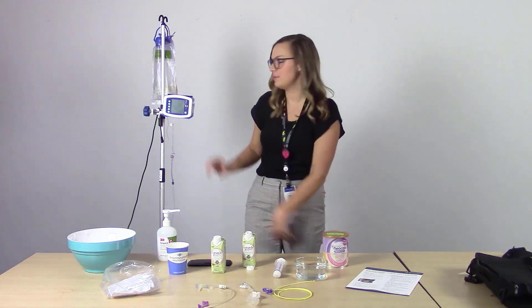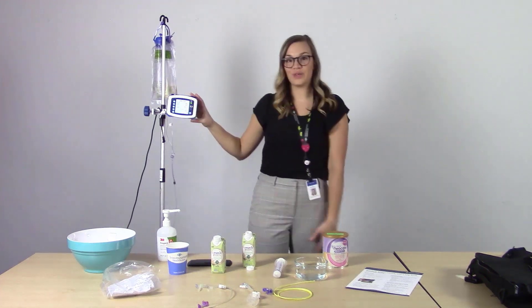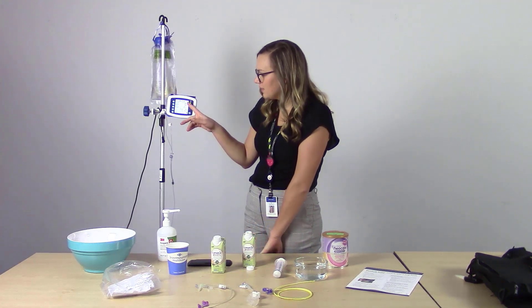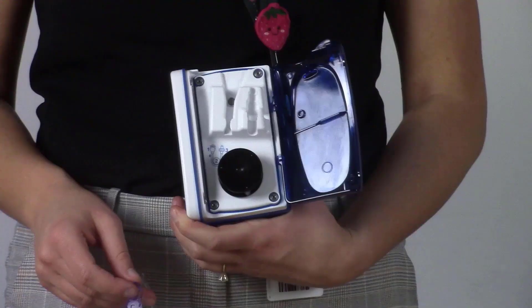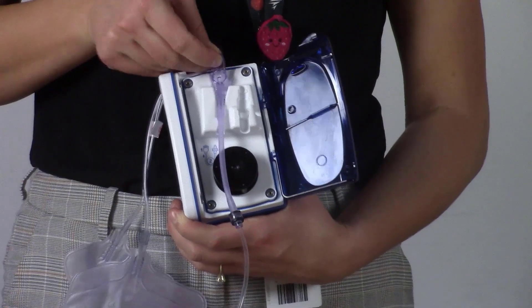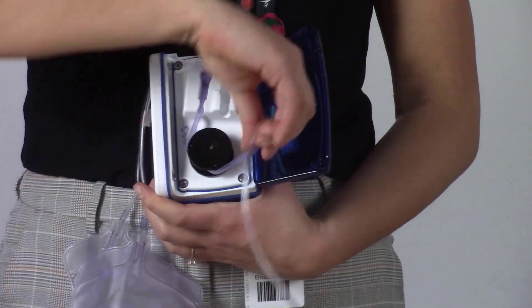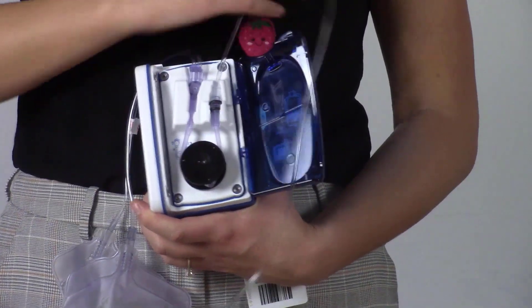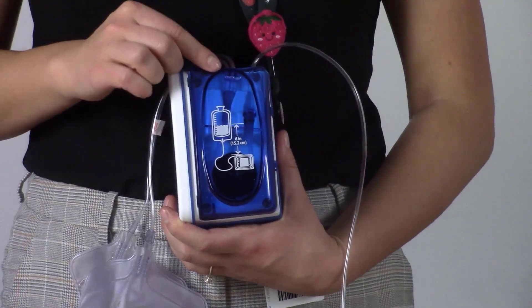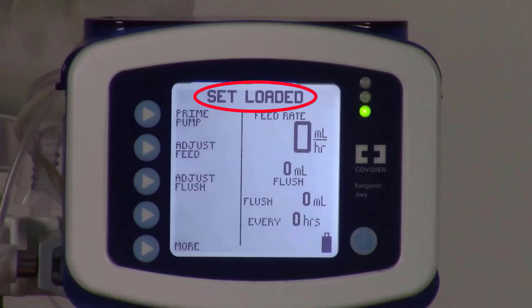Next, we'll power on the pump. We hear the pump powering on. On the screen, it indicates 'load a set.' Take the purple tab facing out and seat it into the first position. Wrap the flexible purple tubing around the rotor and seat the other portion in the second section. Close the door and ensure that the tab lines up with the blue slit. Now we see on the screen it reads 'set loaded.'